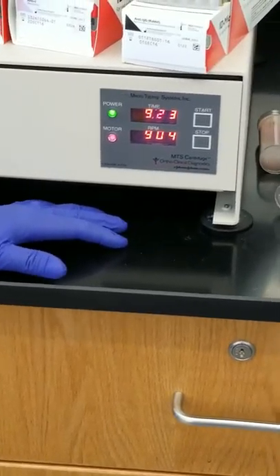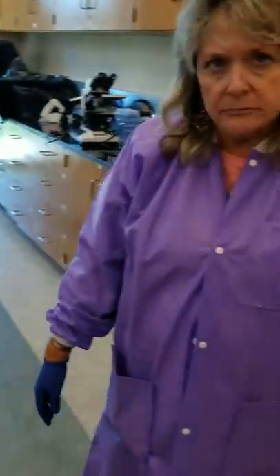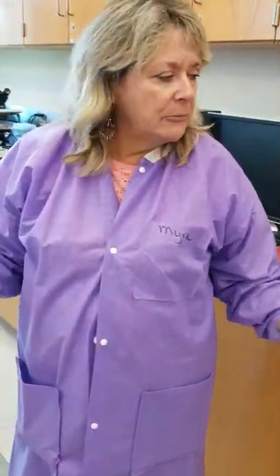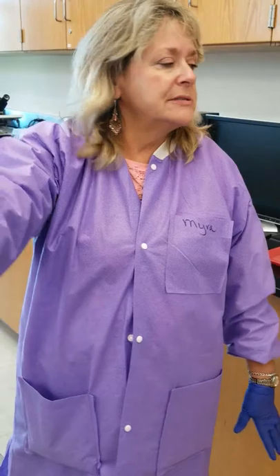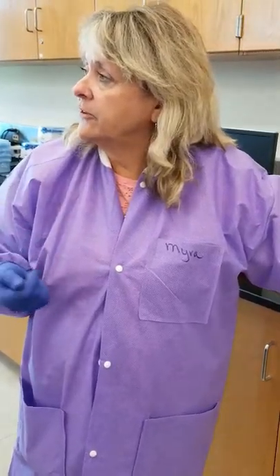So it's going to take 10 minutes for that. That's going to incubate for another 8 minutes and 51 seconds. So what's going to happen when this pops, I'll pull it out and show you what it looks like, because you don't need to stand here for 10 more minutes. And then when that timer goes out, as soon as this one's finished, I'll take those cards over and put that card in here so we can see what the screen looks like.